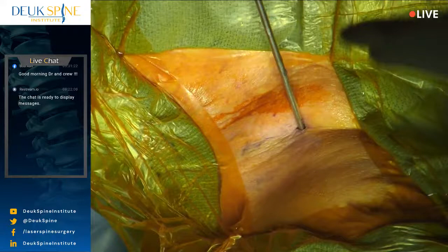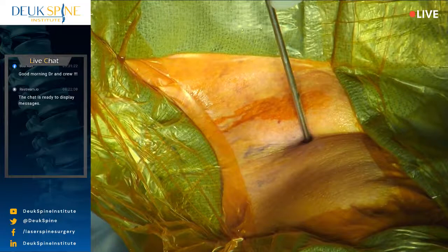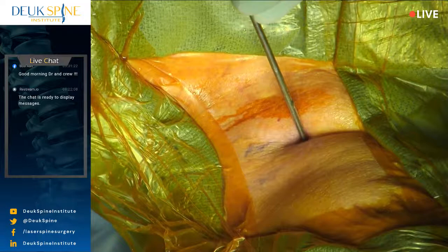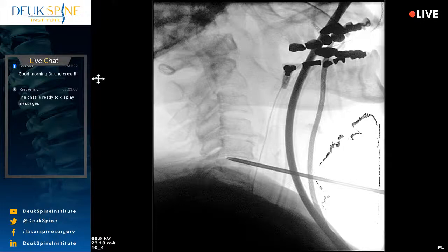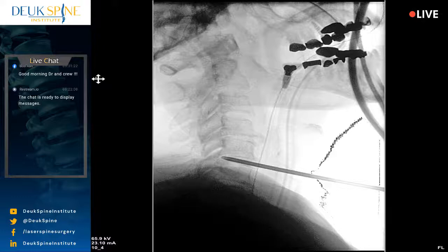Mallet. So I'm right inside the disc and we're gonna enter it, shot. Yep. I'm gonna aim for the back. Okay, you can relax now, shot. Thank you, doctor. Shot. Now we're headed right to the back of the disc where the herniation is. There's a little bit of osteophyte too.